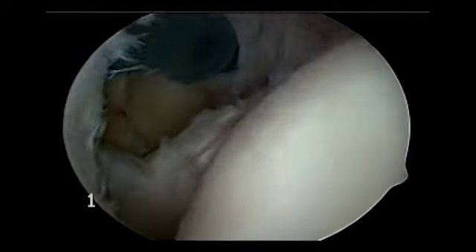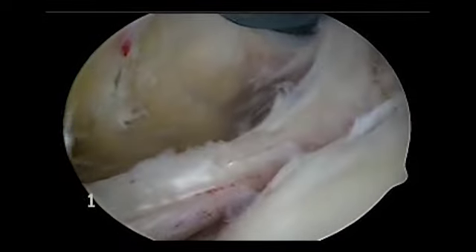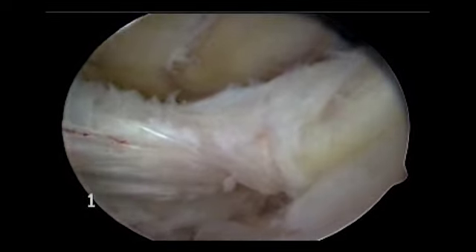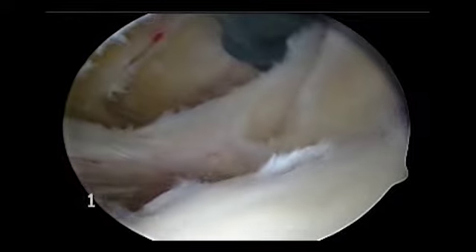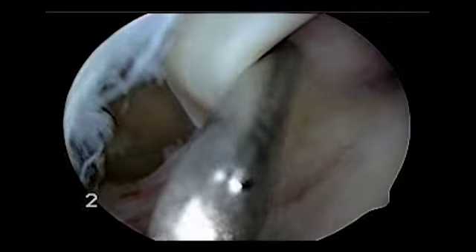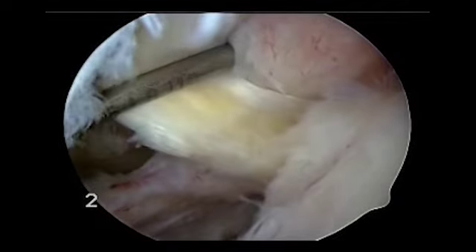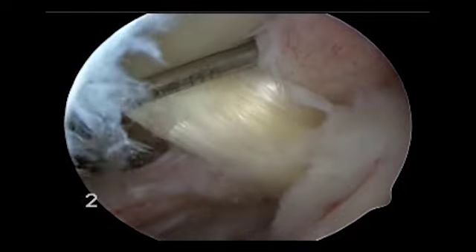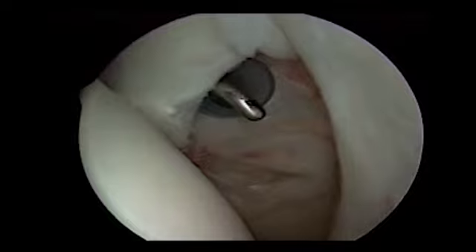Several examples of progressive biceps instability and subluxation are shown, as in this first example in the right shoulder. With internal rotation, we can clearly identify a significant upper border subscapularis detachment. Note the wallowing slightly medially, the medial biceps fraying, and intrinsic changes of the biceps characteristic of a subtle subluxation.